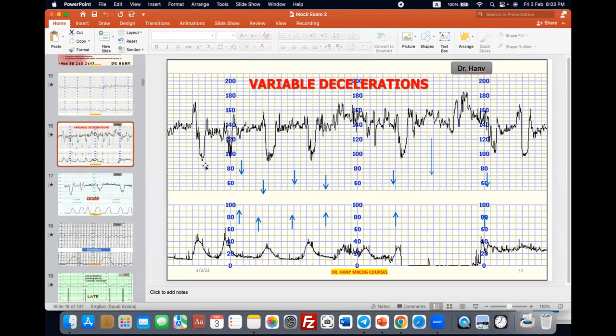Variability in the decelerations is not a concerning character. If it is absent, this is a concerning character. If it does not recover to the normal baseline, or recovers to a lower baseline, this is a concerning character. This is how to understand the CTG. Any query?